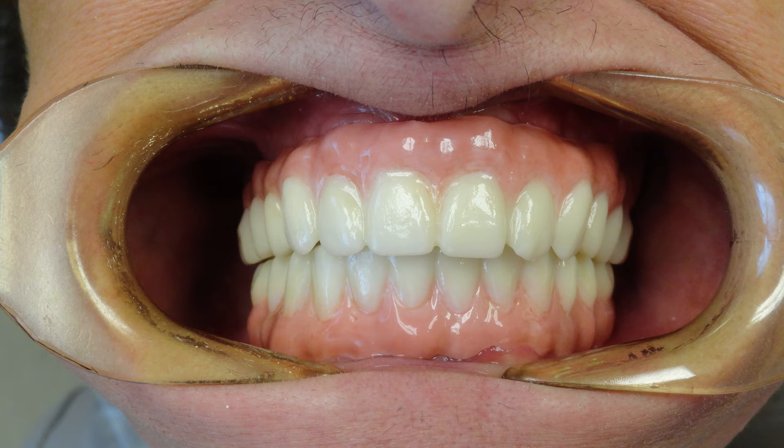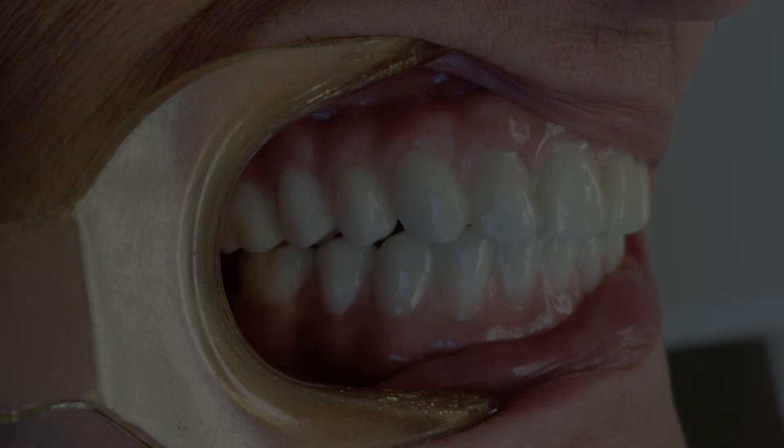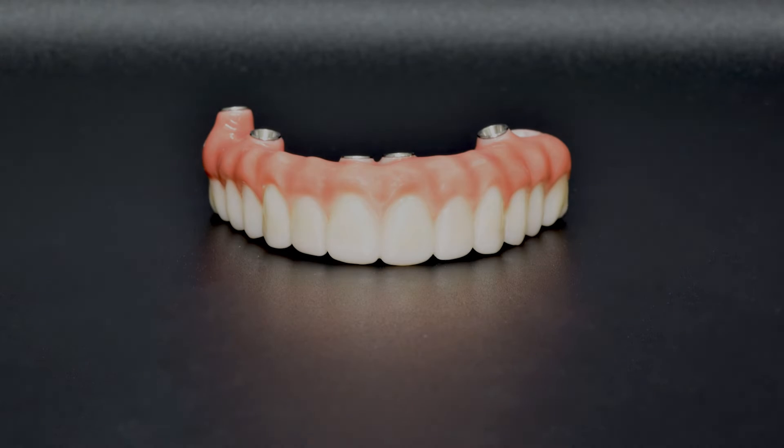The Full Arch Zirconia Implant Prosthesis offers edentulous patients a uniquely highly aesthetic fixed implant solution made from 100% zirconia. The exceptional structural strength of zirconia offers high resistance to chips and fractures while providing the patient with the stability needed to improve chewing and phonetic functions. Using a mixture of traditional denture techniques and the most advanced CAD-CAM technology, we can provide a passive, natural-looking, and precise-fitting restoration.